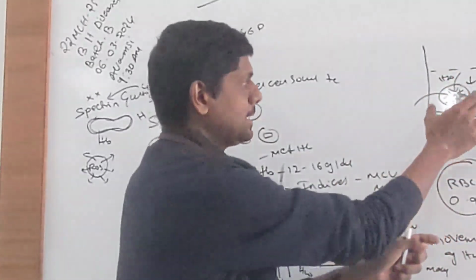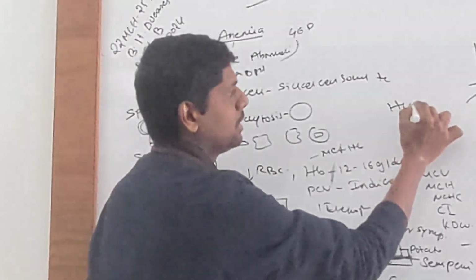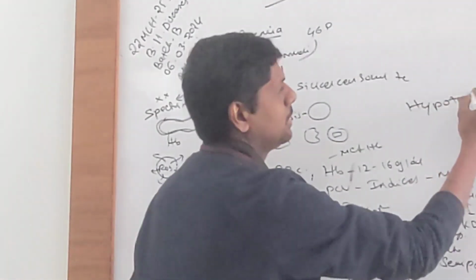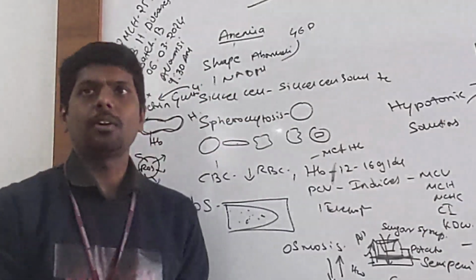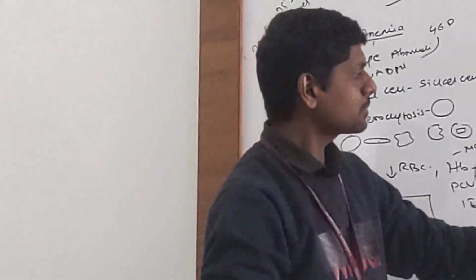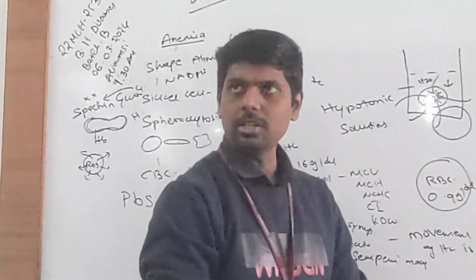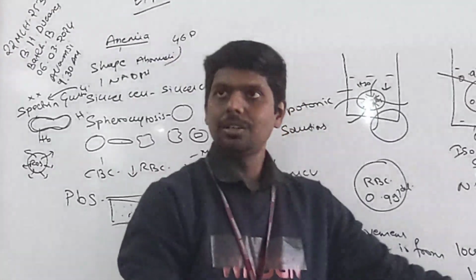Such solutions are called hypotonic solutions. These solutions are called hypotonic. Sir, can you repeat this? The rule of movement of water: low concentration to high concentration.